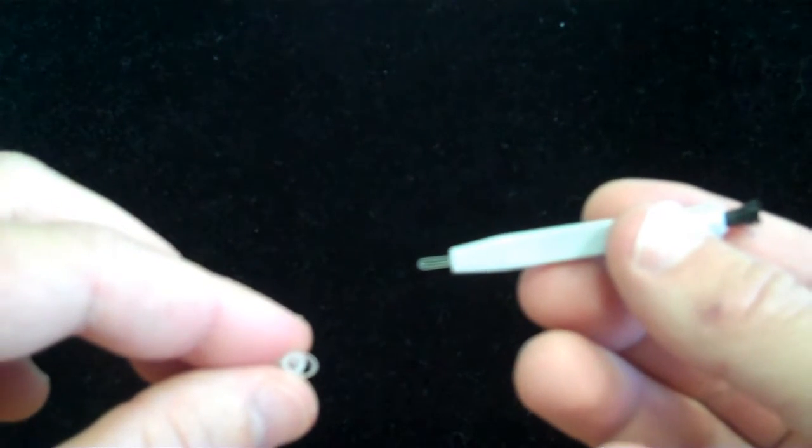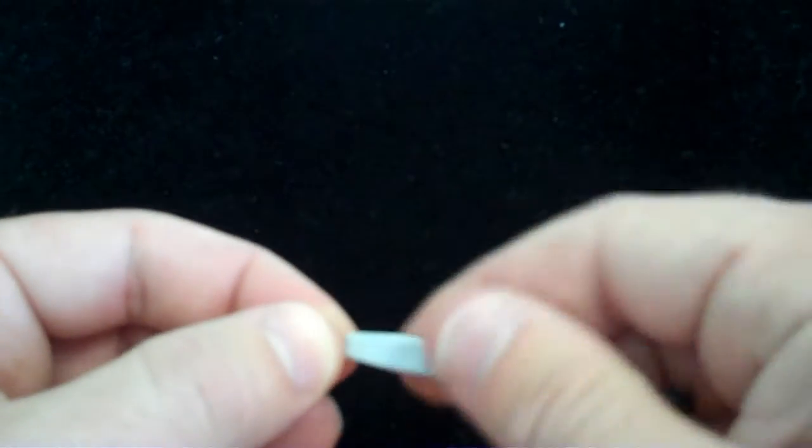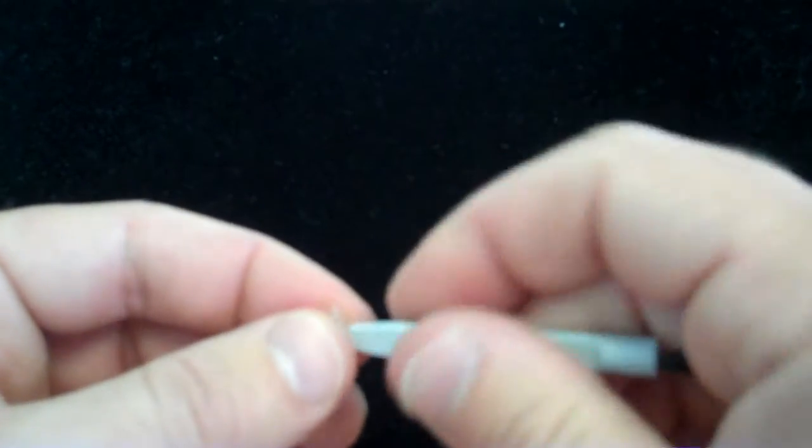I usually recommend the use of a wire loop tool just like this. The dome can be cleaned very easily by inserting the wire loop tool in the end of the dome and cleaning it out like such. Frankly, a paper clip works just fine for cleaning out these domes as well.